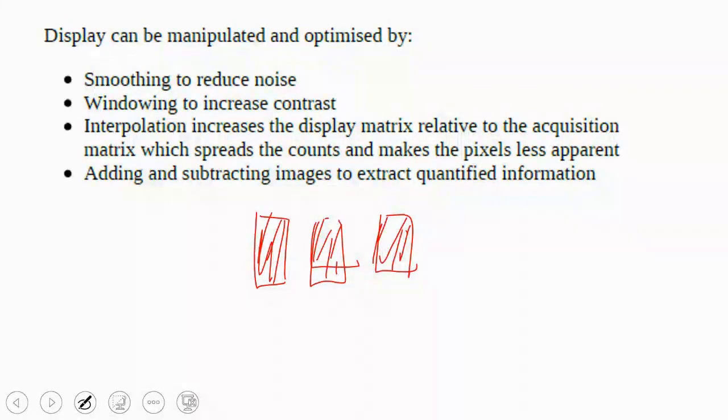For example, this line could be made of lead or a high density material, and next to it there is a gap. Then there is another line next to another gap. When these distances are large enough, your eye can distinguish that these are lines. Each line next to a gap is called a line pair.